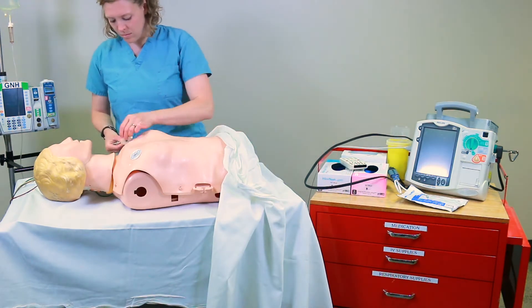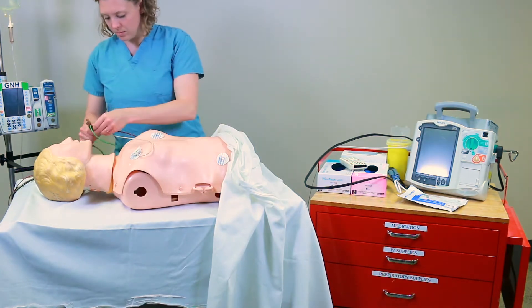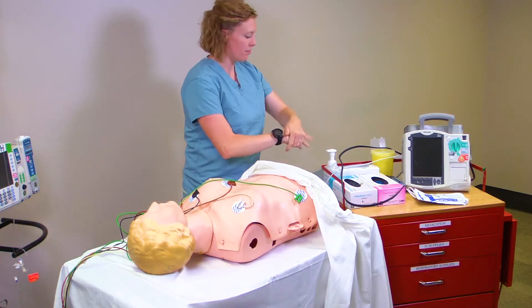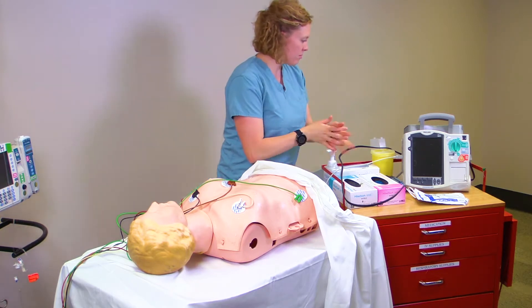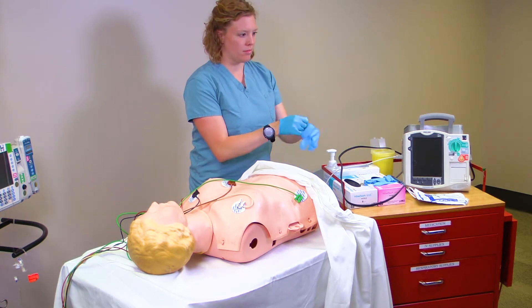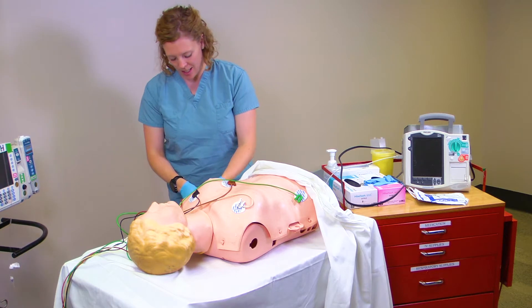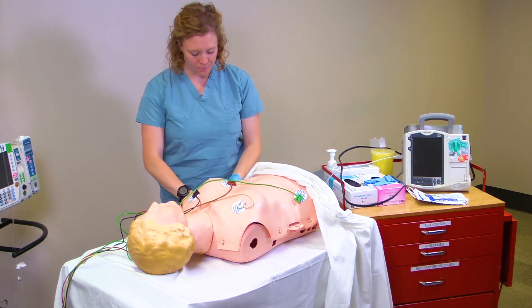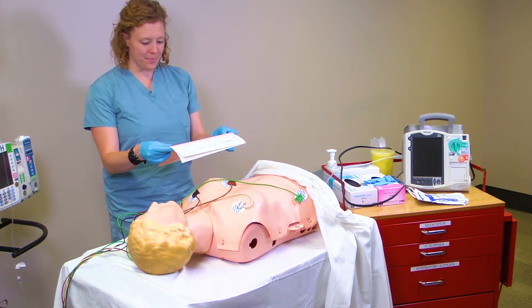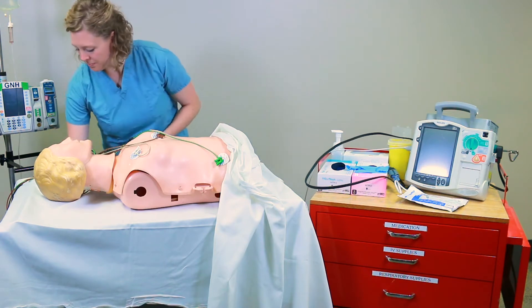First, apply the 5 electrodes and connect leads to the defibrillator. Perform hand hygiene and apply clean gloves. Perform IV insertion and connect patient to IV solution at ordered rate or to keep vein open. Obtain a 12-lead ECG.